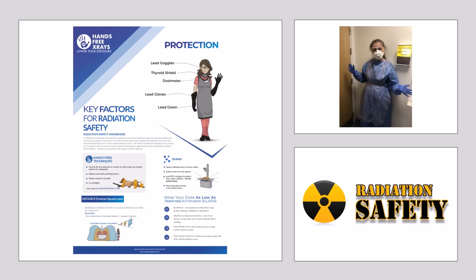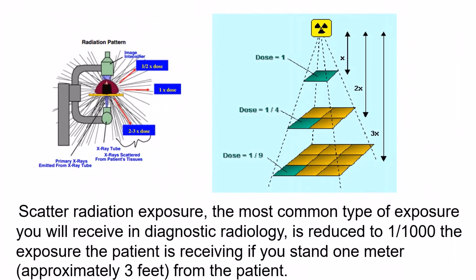Whole dose radiation is the whole dose that we receive to the body. But remember, under these areas that are protected, there's a different amount of radiation that actually interfaces with the tissue. To make it a little bit more obvious, let's take a look at the surgeon or radiographer working with a C-arm in surgery.